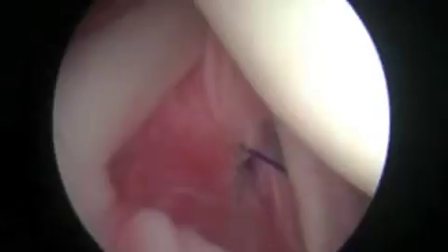Now this is a little different view. This is looking from the front of the shoulder, and we're looking right down the front of the shoulder, and that metal instrument is coming from the back of the shoulder, and we're pushing on that labrum, and see how it's nicely snug up against the socket. So that's a secure repair. You can see those knots that we previously tied that are cinching the labrum back down to the bone. And then this is a suture that we're using to close up that cannula hole, and then we're all done.